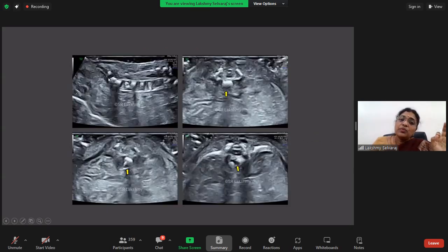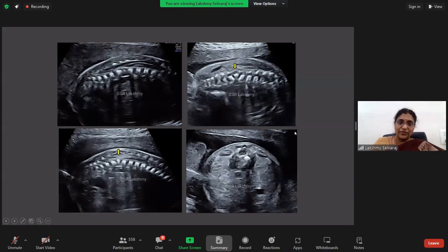When we come to vertebral abnormalities, you can have missing unossified vertebral bodies, and whenever you have the axial sections, you can also look for this divergence here. And look at that. You can have a missing half of the vertebral body or clefts running across the vertebra. These are all vertebral body abnormalities that you can identify.